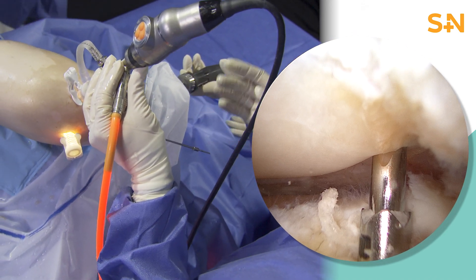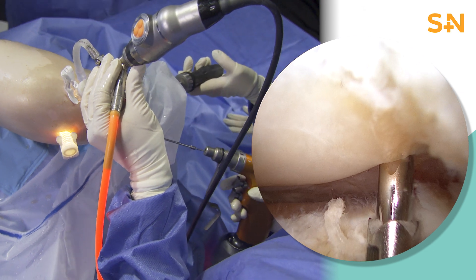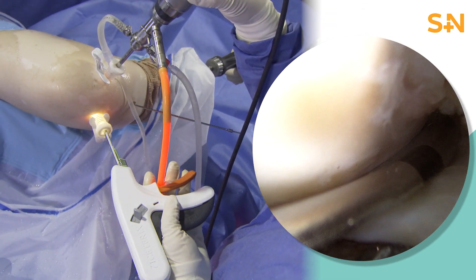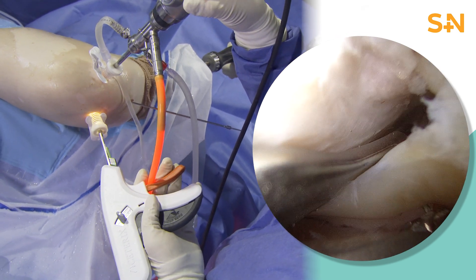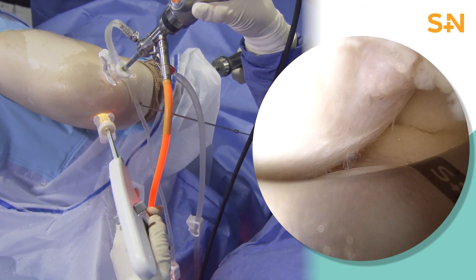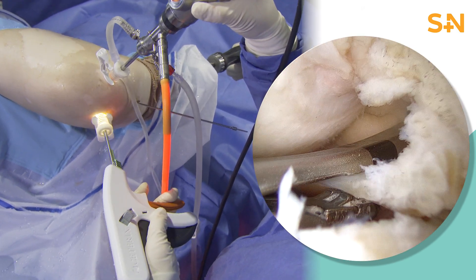Using a guide, we've drilled a cannulated drill system up into that anatomic insertion site for that lateral meniscus, which will then allow us to pass the sutures that we're placing through the meniscus down through the tibia for excellent fixation in that prepared anatomic insertion site.